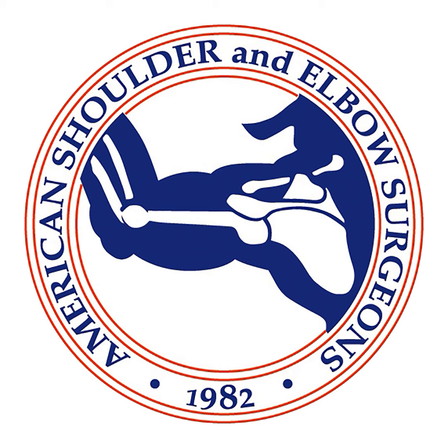If I explant a cemented stem that's well fixed and not infected, sometimes you can bang the stem out and leave the cement mantle behind, rather than chip out the cement mantle and spend a lot of time doing that. If it's not infected, I will cement a shorter stem into that old cement mantle. So I've done that a number of times, and that can turn what would otherwise be a pretty hairy revision into a pretty straightforward revision case. So that's probably the only time I cement something. Even on reverses for fracture, I can't think of the last time I've cemented a stem in a fracture setting either.